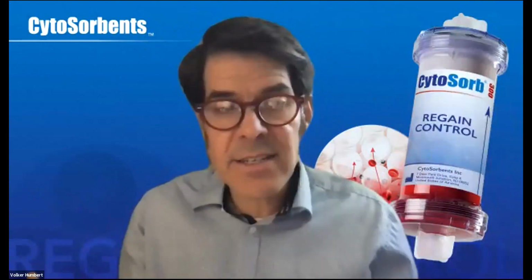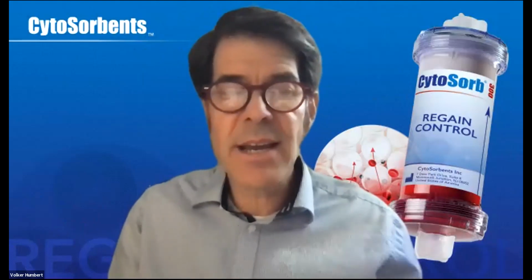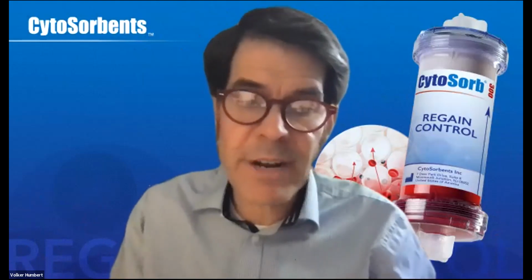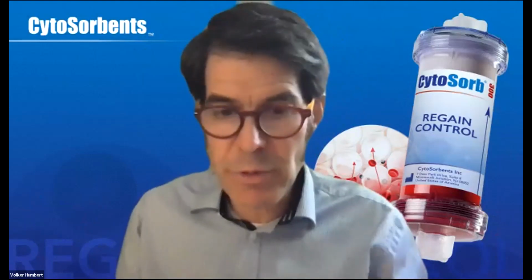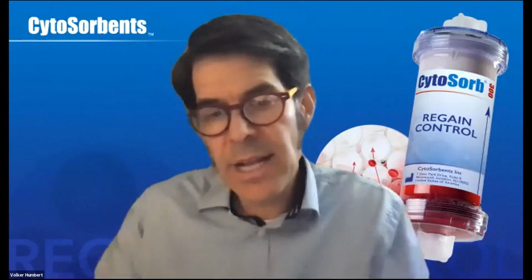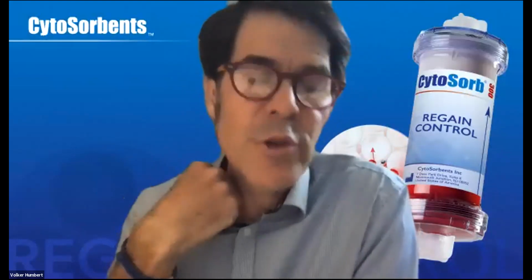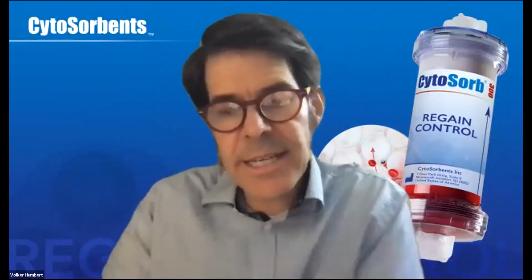And if you look at one interleukin, maybe IL-6, this is just one single piece. The Cytosorb adsorber is confronted with many different substances to be removed, and this is, of course, different from patient to patient. So exact removal rates vary depending on the concentration and also on the other substances which have to be removed as well. That's why it's very individual, and you cannot generally say Cytosorb always removes 80% of IL-6 within the first 2 hours, because in another patient it might only be 30%, in another patient 40%. So it's too individual.